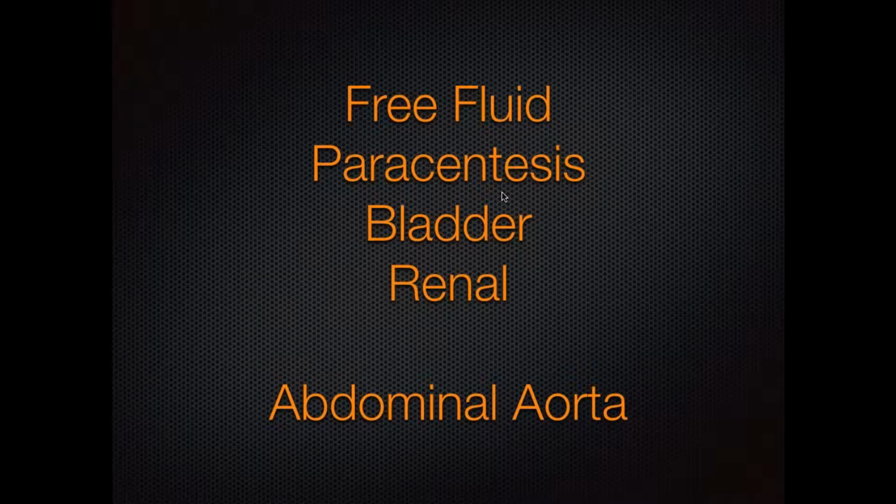So we've sort of covered the following. We've covered the technique in looking for free fluid. We've also touched on what are some of the pitfalls and what are the things you really want to look at. The pointiness of the free fluid, you want to make sure it's not bordered by hyperechoic areas. Those are the things that can fool you.